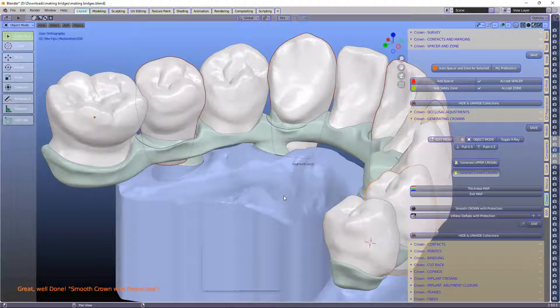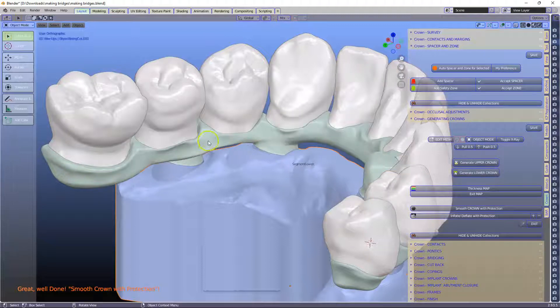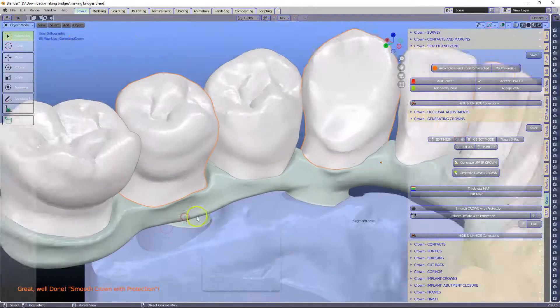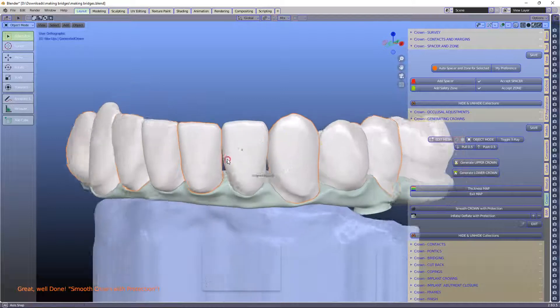Let's see how forgiving this actually is. Let's generate the lower crowns. This can take maybe a minute, so just let it do its thing and be patient. Good — okay, so maybe under a minute. You can see how it's actually jumped to the margin, which is really awesome. I'm stoked with that.